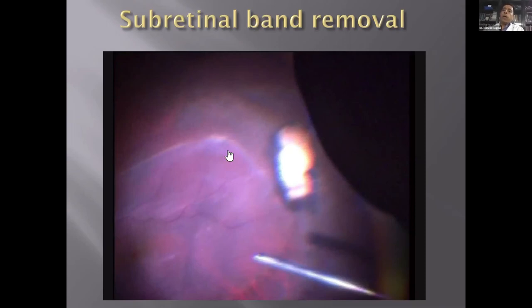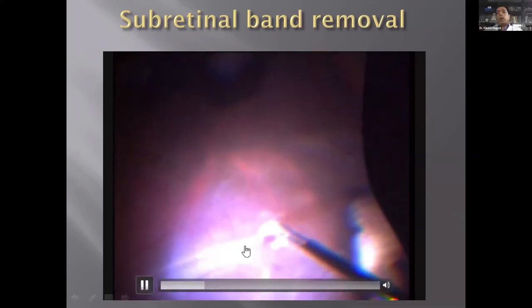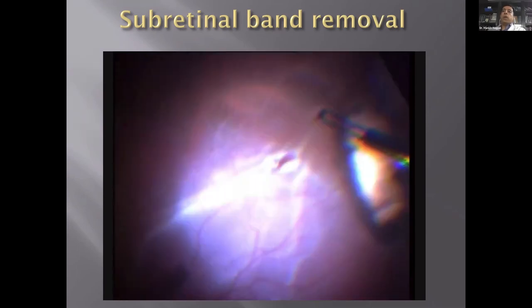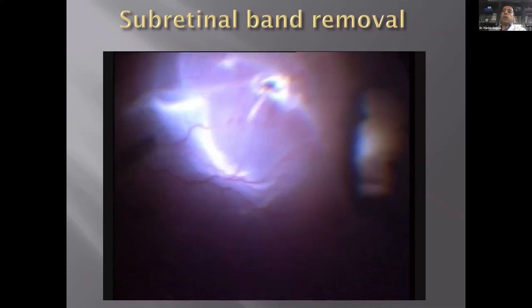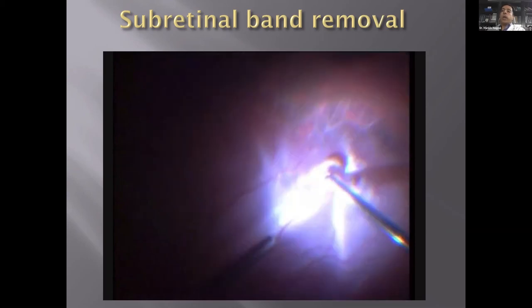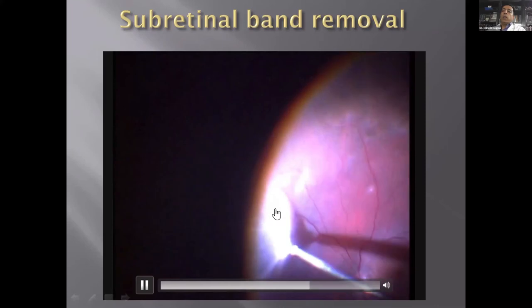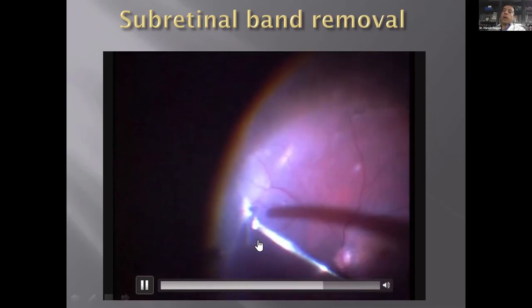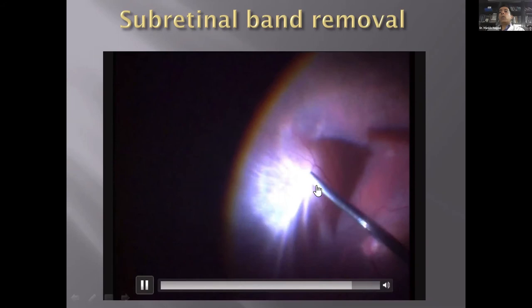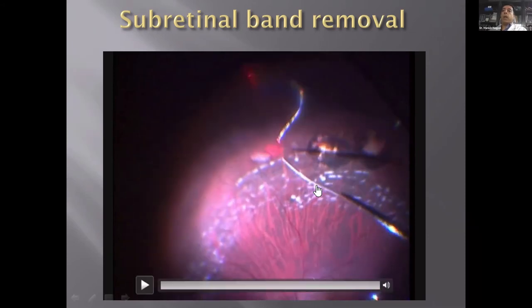At times there are radiating subretinal bands which create a stretching effect on the retina. If the retina is flat you can leave them, but if there is obvious traction you should remove them. Here we pulled the band but it broke because it was extending to the other end of the retina — in that case you can leave it because the retina will flatten. If you can pick it up from the other end, that part can come off too. If it cannot be removed easily, just release it so it does not apply undue stress to the retina — totally removing the band can be traumatic.